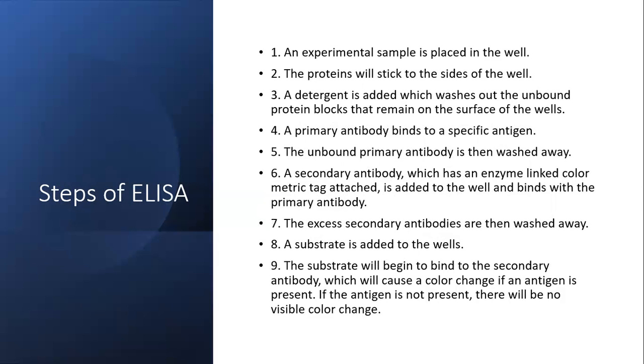Then the substrate is added to the wells. The substrate will begin to bind to the secondary antibody, and this is what will cause the color change if the antigen is present. If the antigen is not present, there will be no visible color change.